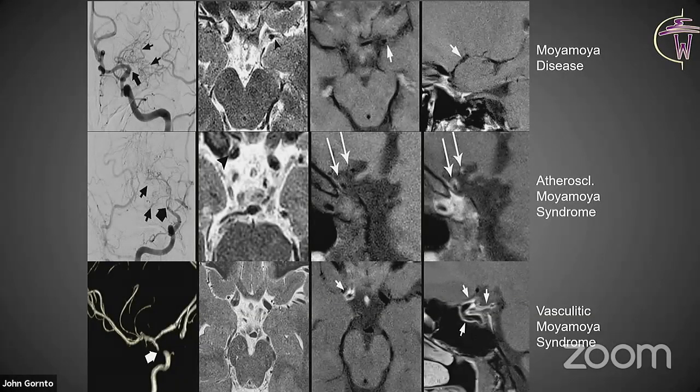And just to show you similarly with Moyamoya disease, we typically don't see wall thickening, and you can see on the T2 there's not much wall thickening involving that left carotid terminus and MCA that are occluded. And there's not much wall thickening and enhancement that we see on the T1 post. While with atherosclerosis, we see this mushroom cloud of enhancement and eccentric wall thickening, both involving the carotid terminus and the ACA here. And then in the setting of vasculitis, everything is kind of enhancing.